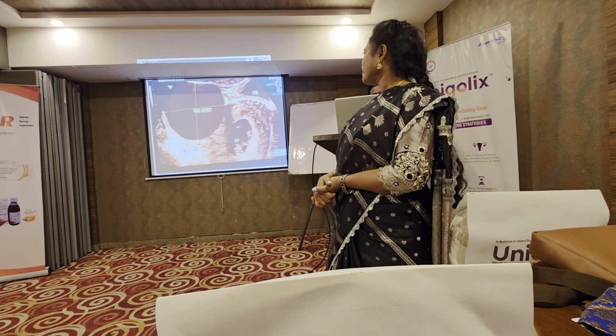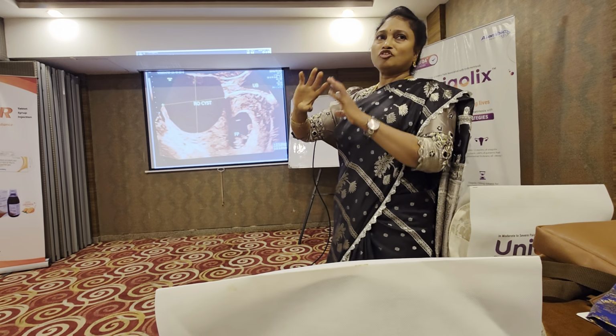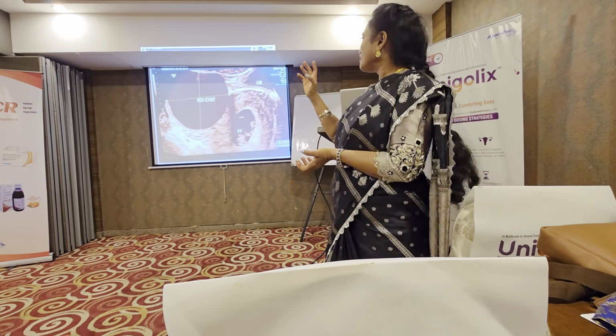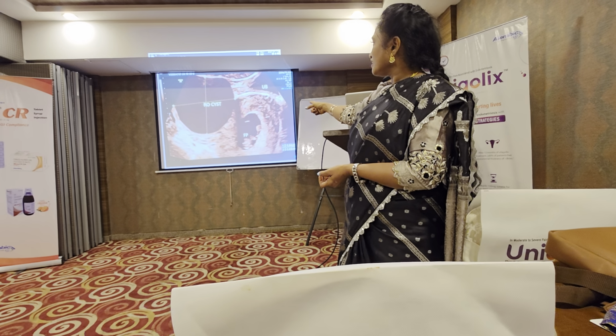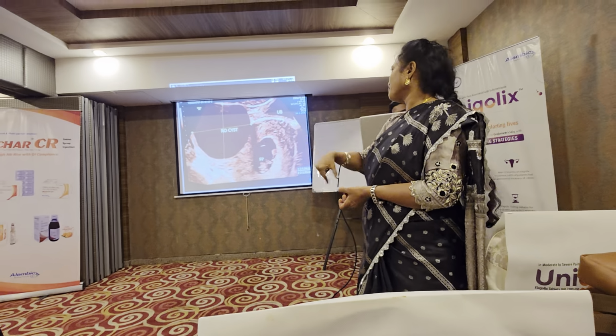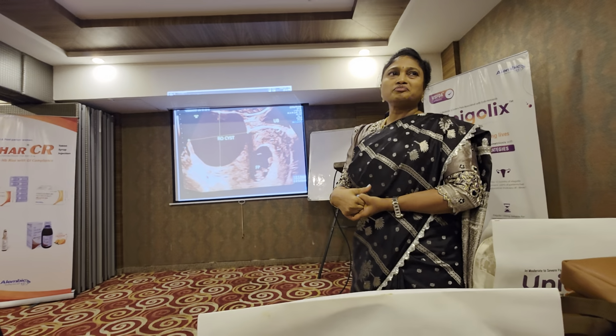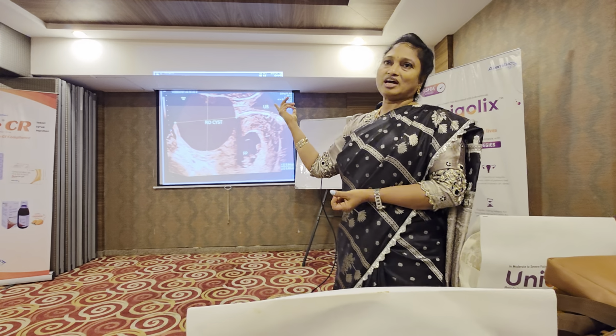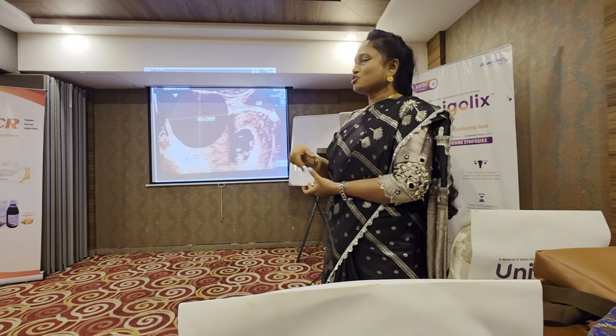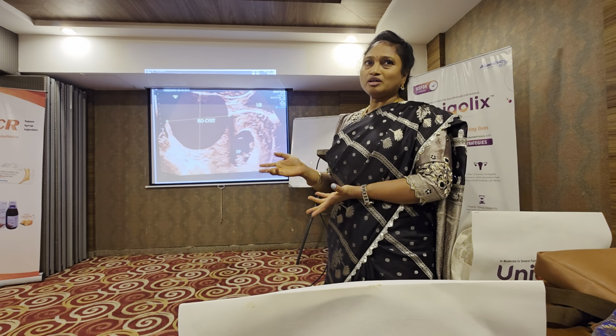Next one. So this is the environment. Now we have finished with the baby. Now we come to the environment. So there's a small fetal pole there with a huge cyst. So follow up this baby around 1 week or so. If it's still continuing, then you will have to go for a laparoscopic removal of the cyst even during pregnancy.